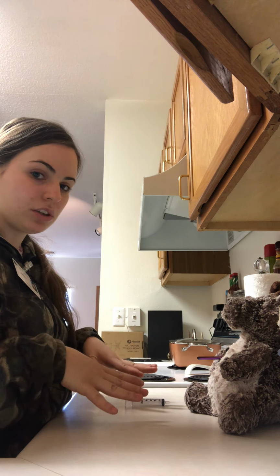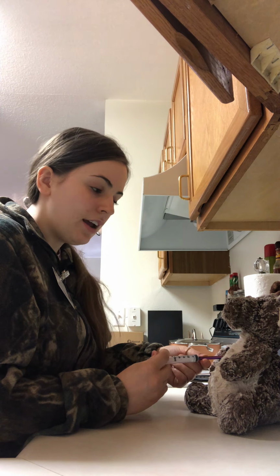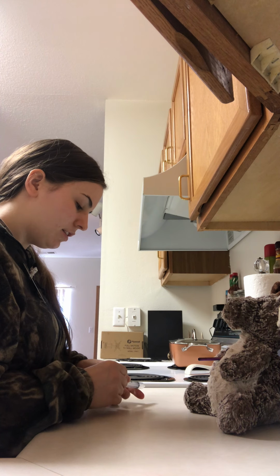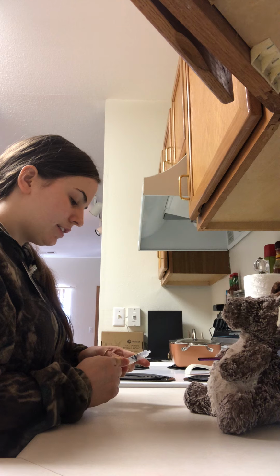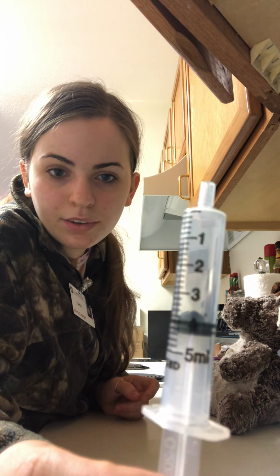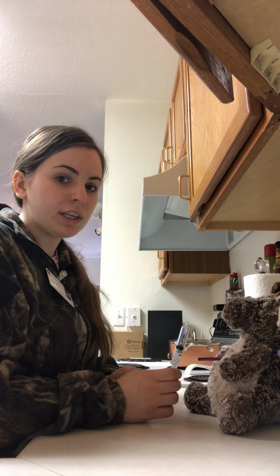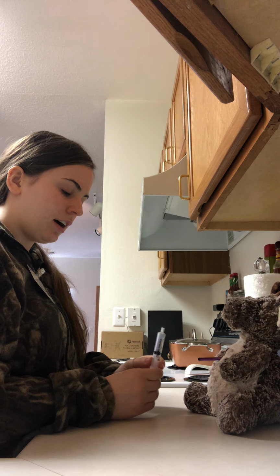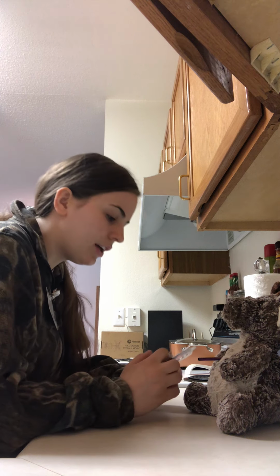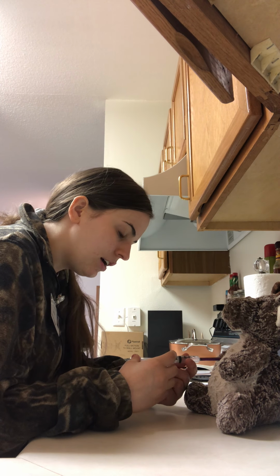And I'm not having any resistance here, so the line is patent. And then I am going to draw up the 4 mL of Lasix, which would equal 40 milligrams because it's 10 milligrams a mL. So that's 4, and I'm going to give it over 1.5 minutes. You can give it between 1 and 2 minutes. So I'm going to scrub the hub again for 30 seconds and wait for it to dry. And then I am going to administer the Lasix over 1 minute 30.